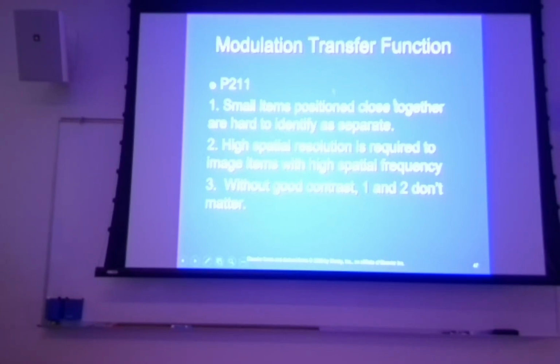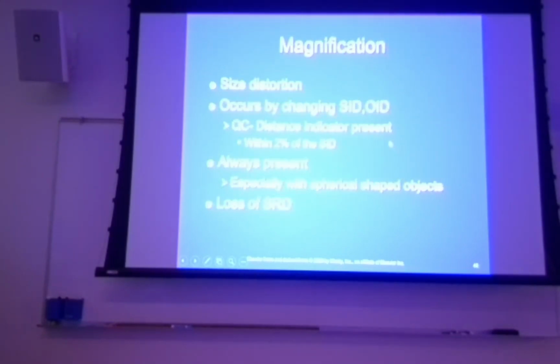So for our purposes, how we're going to define modulation transfer is kind of like spatial resolution married to contrast resolution, because without the contrast resolution, spatial resolution doesn't really matter at all.